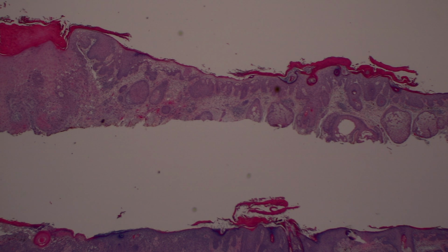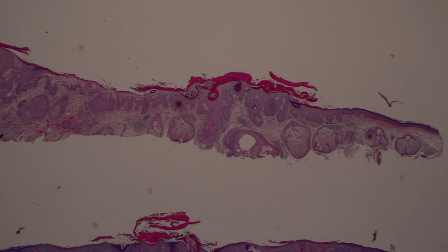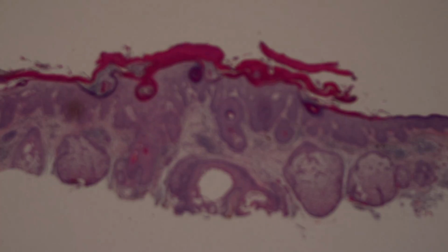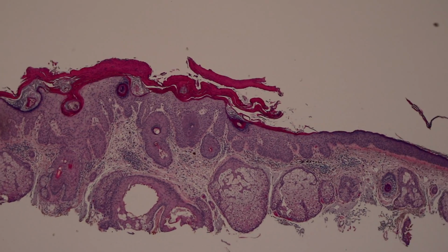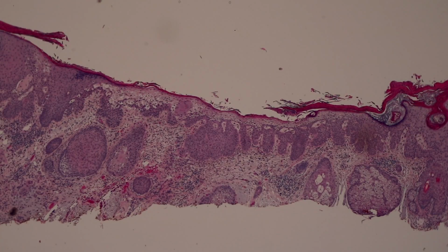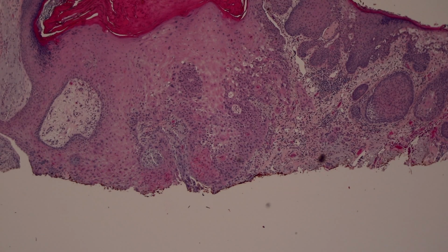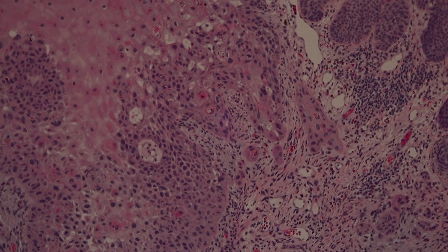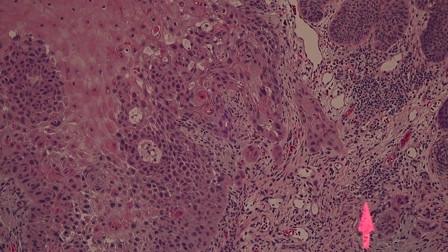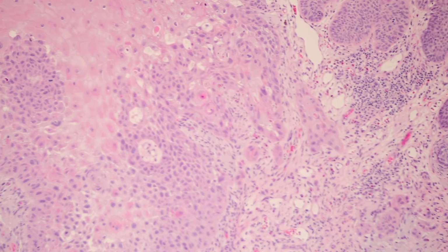And this case nicely shows a progression. So sometimes you do see a progression. Over here we have what looks like actinic keratosis with partial thickness atypia. Then you have areas like this where you get invasion, and again, look at how pink and glassy the keratinocytes get when they invade the dermis. They get a bunch of that pink cytoplasm. You can see here's a squame right here, and then here are little islands down here that are invading as well.